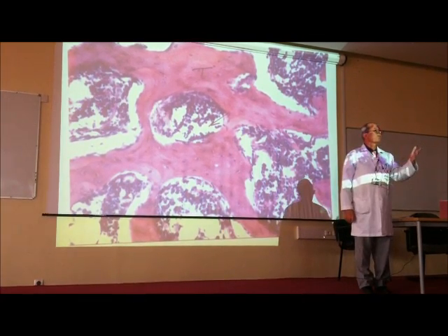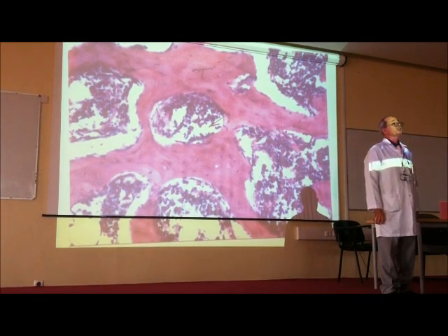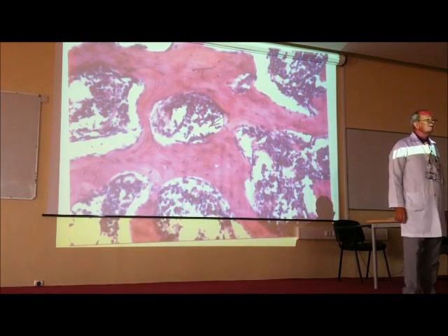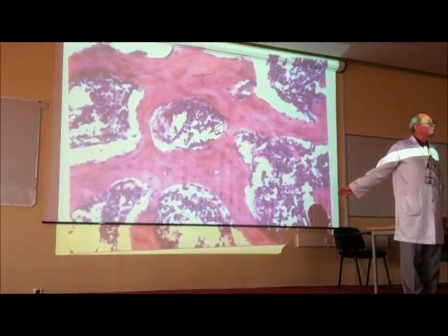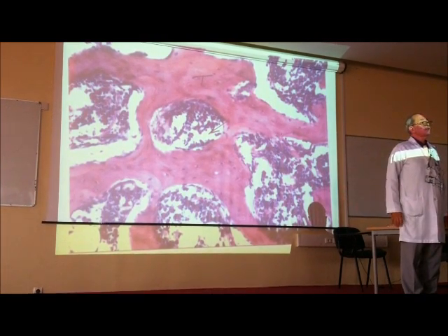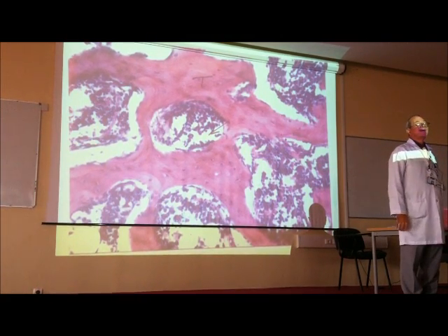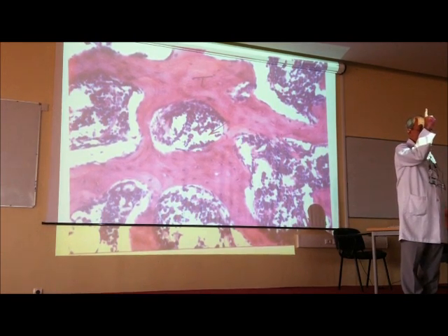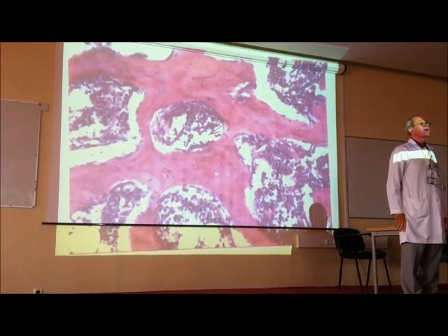Why is the bone acidophilic? Red. Rich in what? We removed the calcium to make this section. Because this section, it will split cells. Collagen. Rich in collagen. Which type of collagen? Type 2? Type 1.